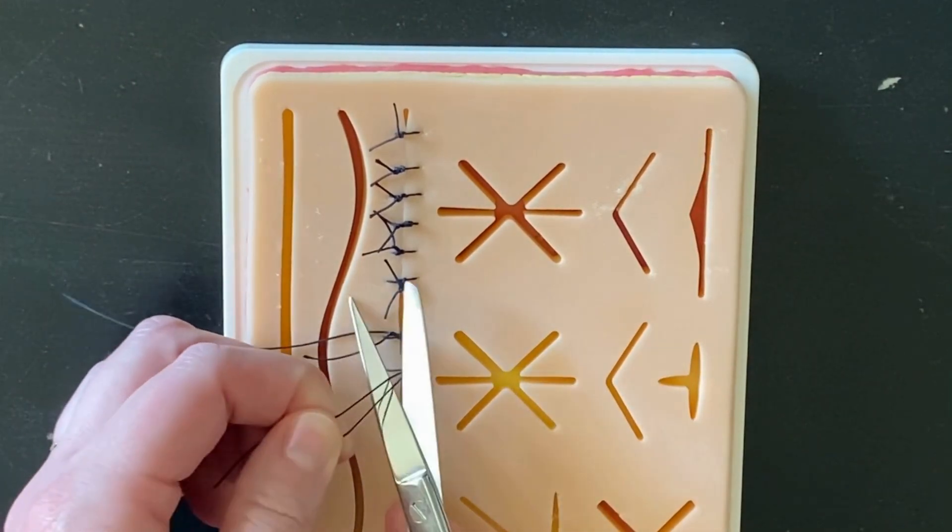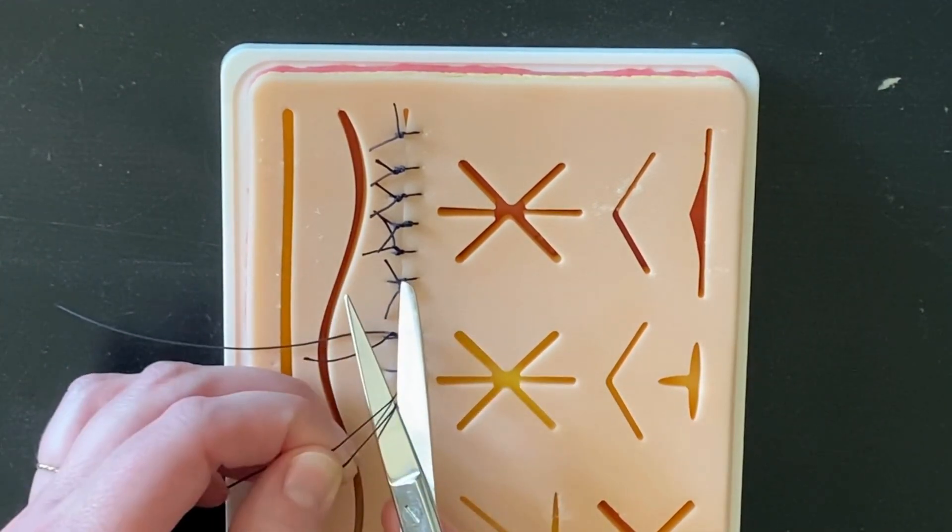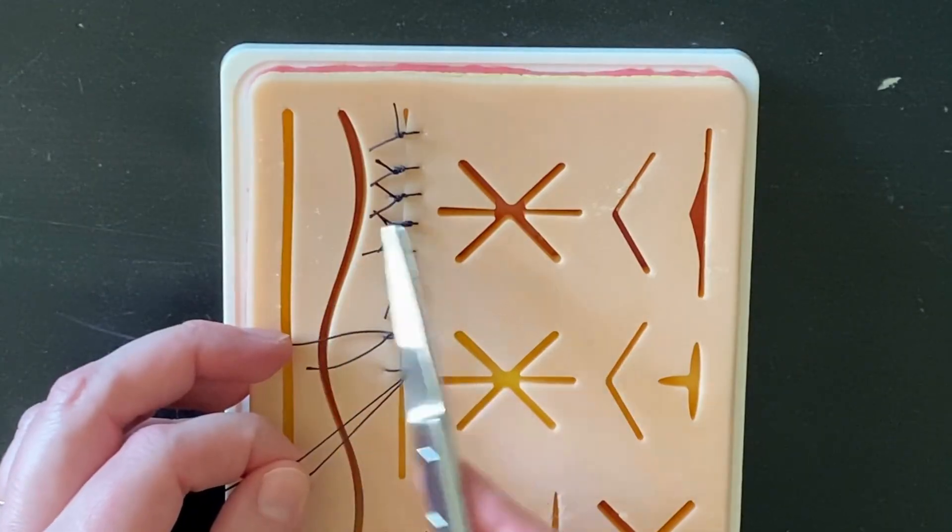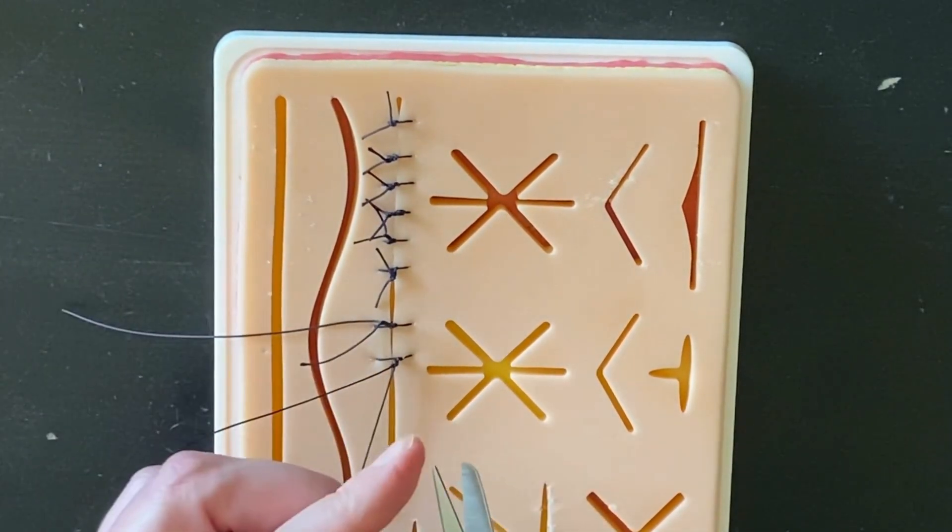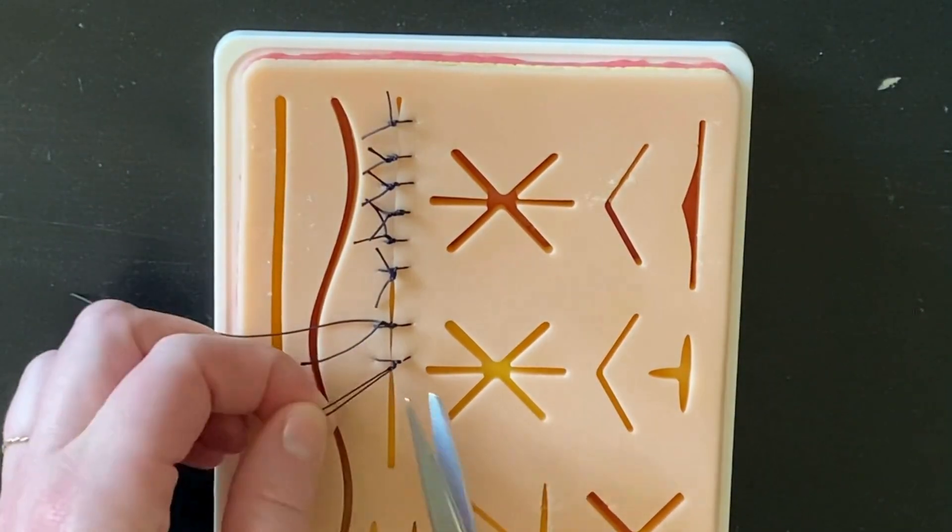It's important not to cut the suture with a large amount of tine through the suture. You never know what kind of anatomy or other sutures are going to be on the other side of the suture that you're cutting that you could compromise. So you're really wanting to cut with the tips of the suture.